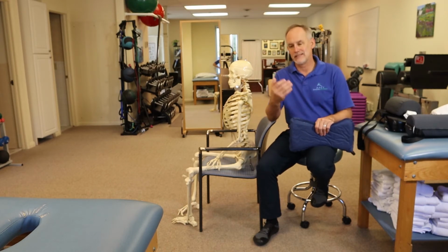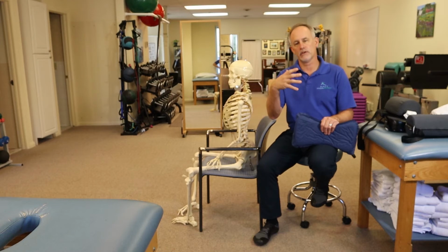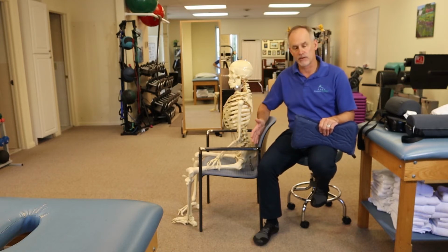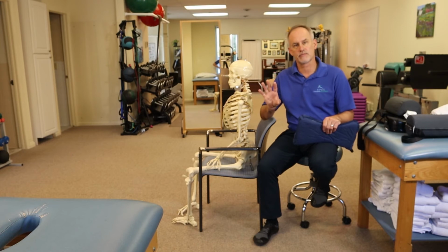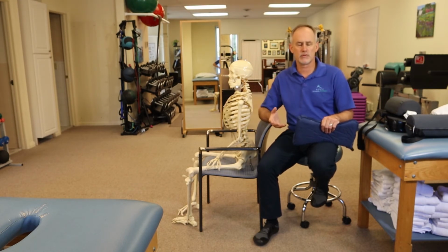If you're in a very deep, low couch, things like that, the roll won't work as well. It'll be harder. The couch will kind of suck it up. So you want a chair that, if you're going to use the roll, has a pretty good firm back. One of the things too is you'll find in cars they have a lot of these lumbar supports, but sometimes they're just not meant for your size person, and you have to play around with seat heights and all that. So consider that when you're using these rolls.